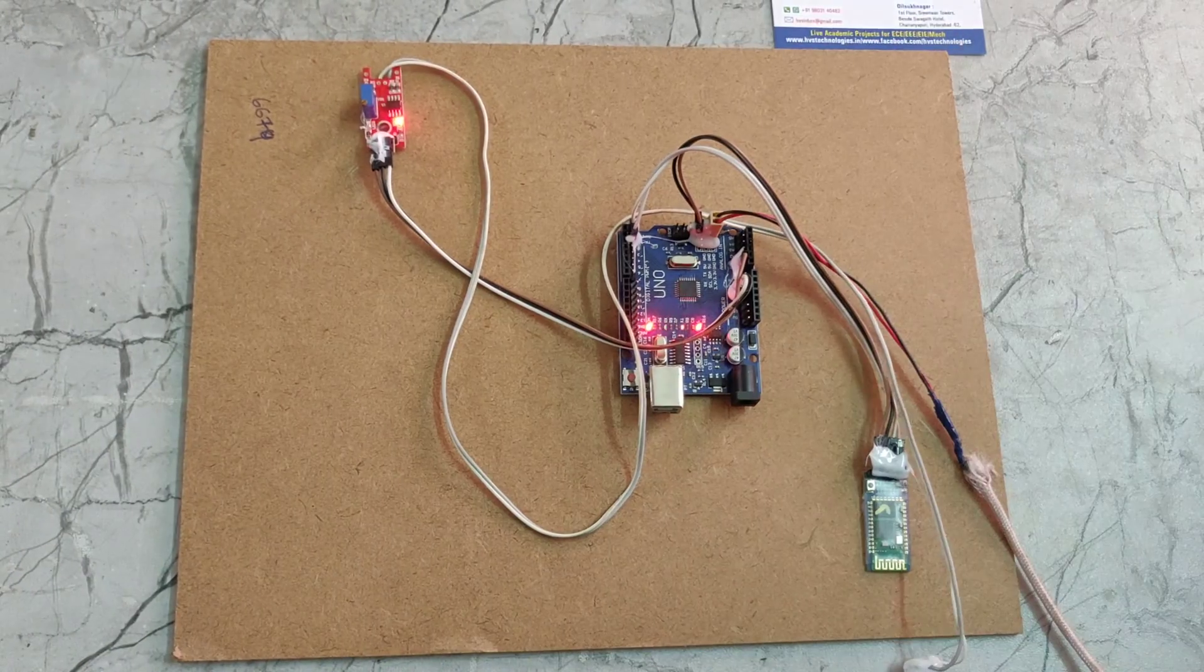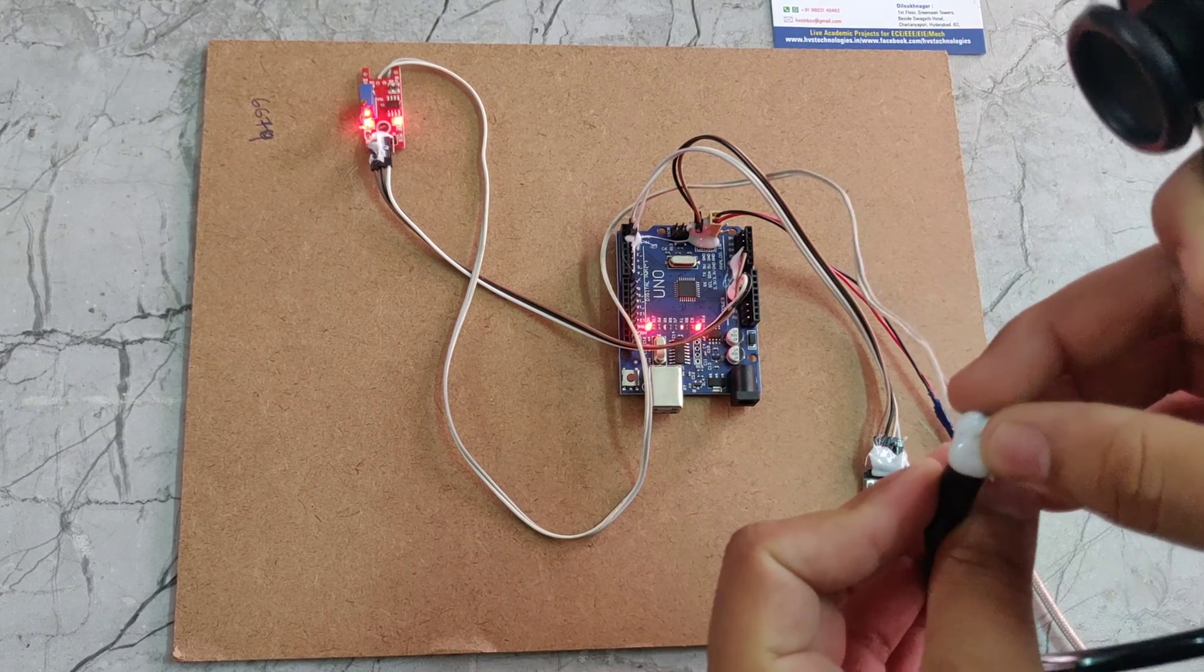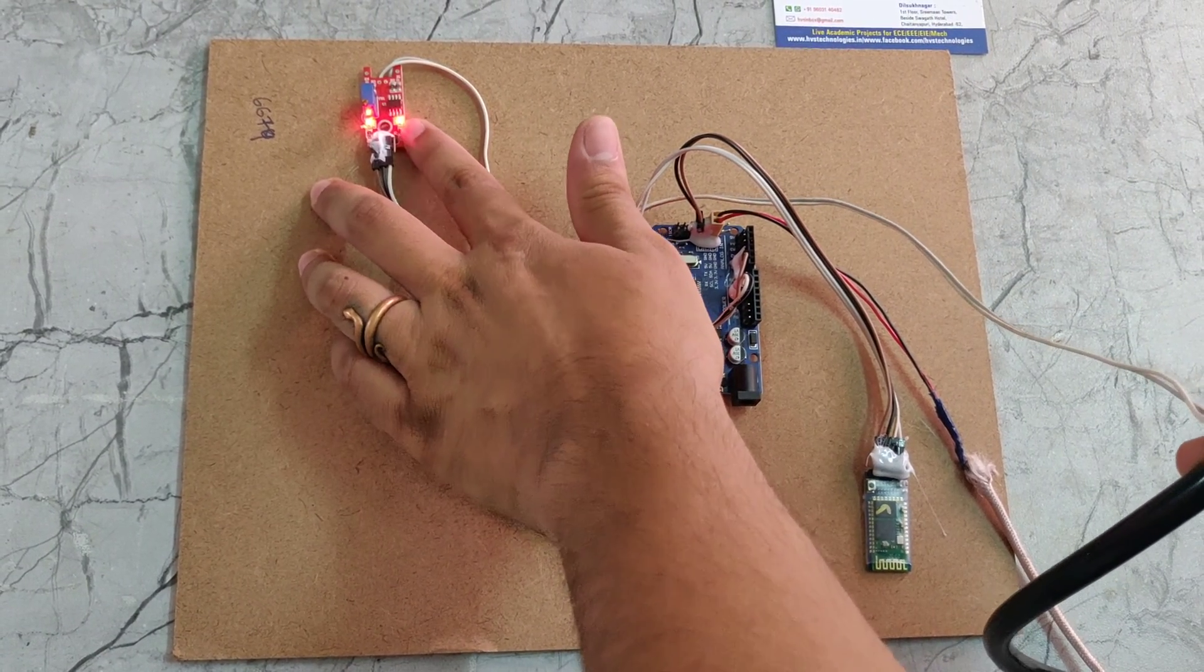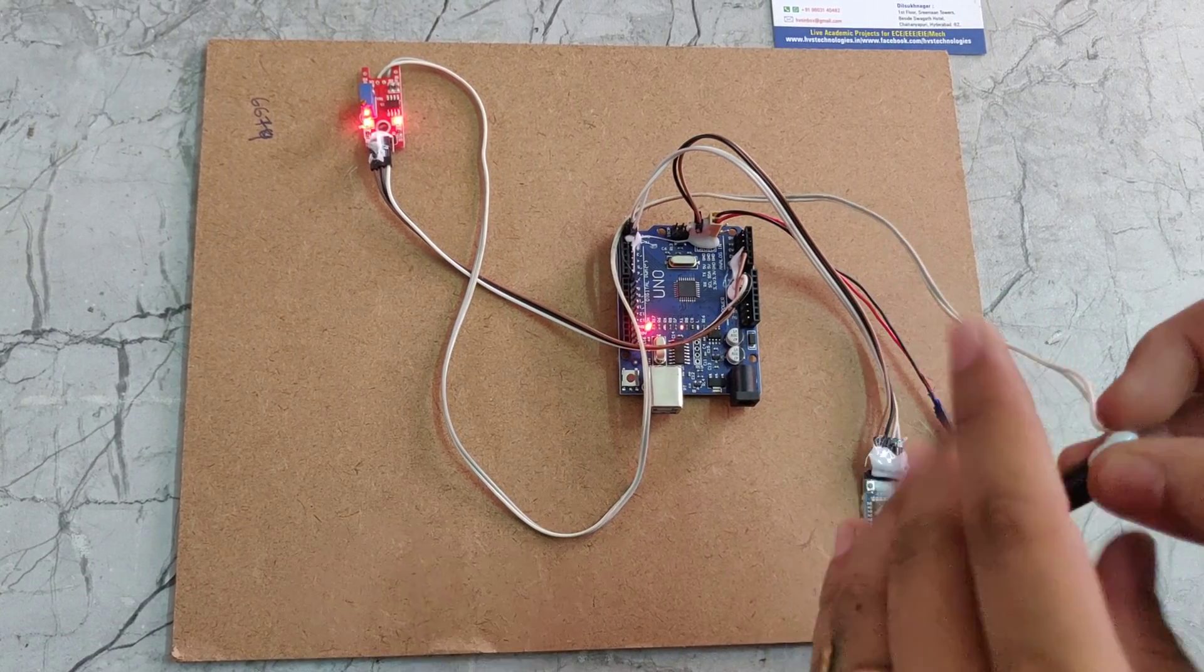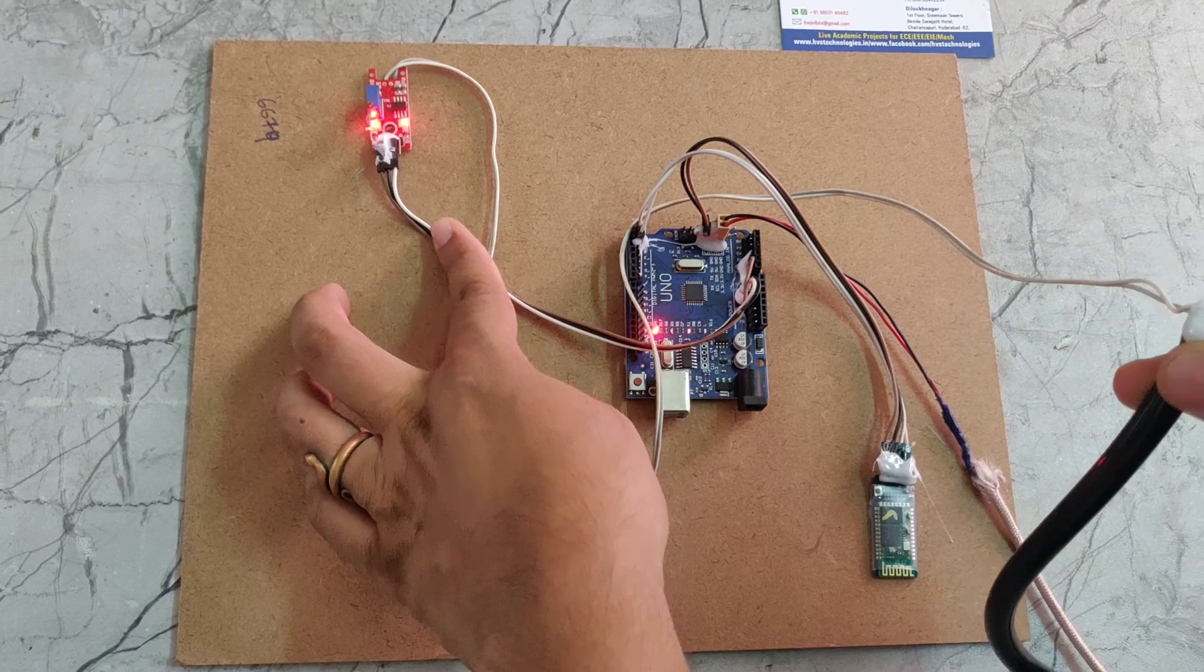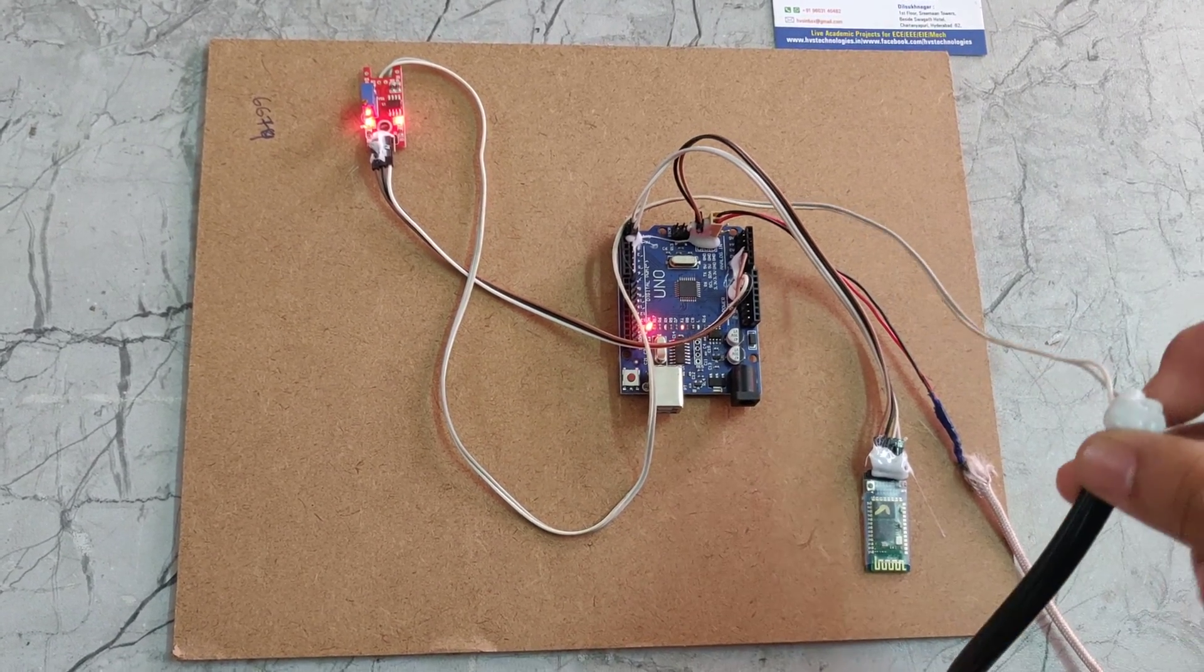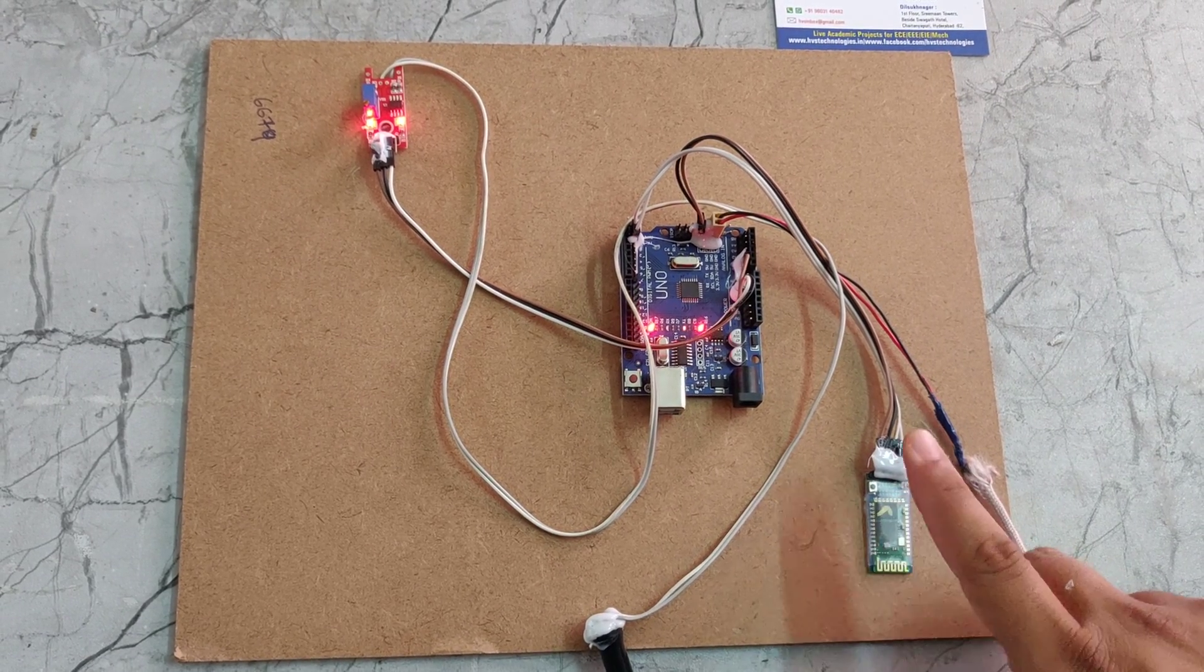Here we can see the mic. This mic will give the signal to this sensor. This sensor will detect the signals. The signals will be amplified. Amplified signals will be given to A0. Then A0 will calculate the analog values. Those values will be given to this Bluetooth module.